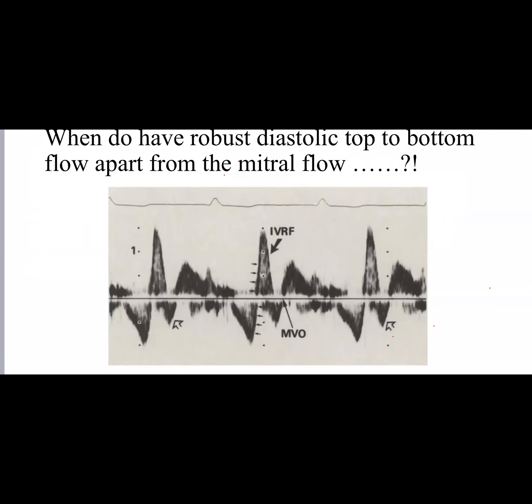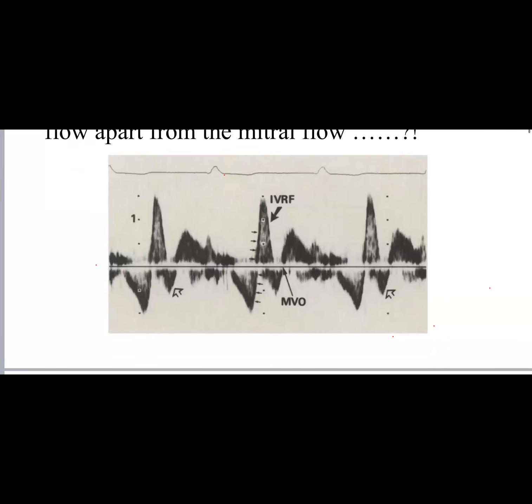Now, see here, sometimes, not always, you can demonstrate this one here. This is mitral. This part is what? This is the aortic outflow. And it looks dagger, right? You agree? Good. Now what is this? This is the E wave of the mitral. I have no problem with these two. But usually we don't see this one here. This is so unusual.